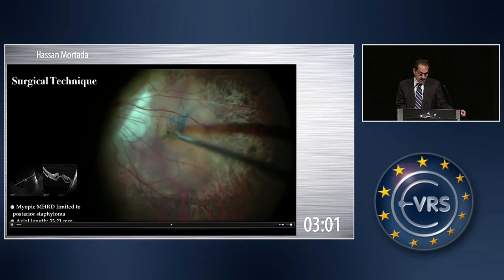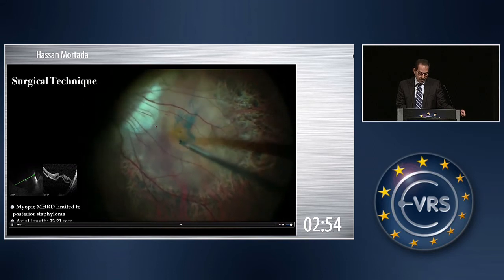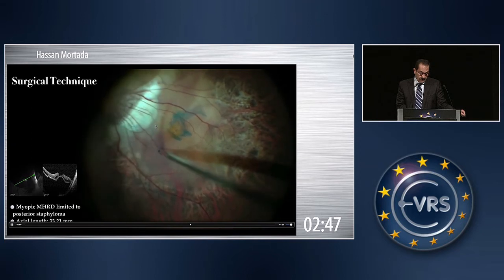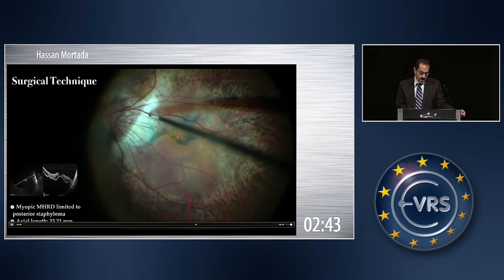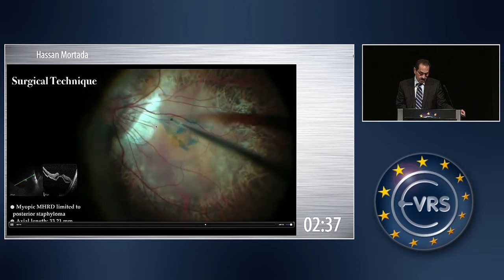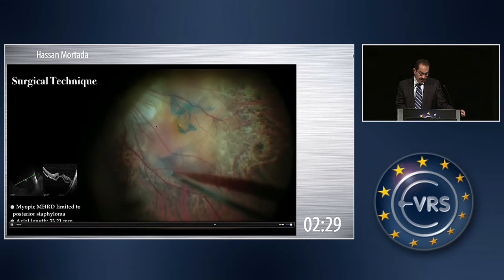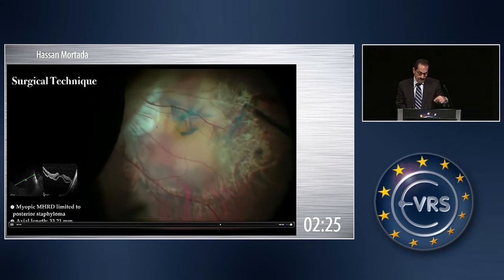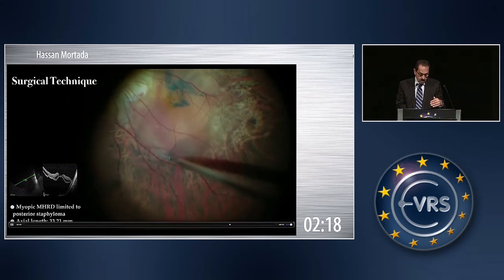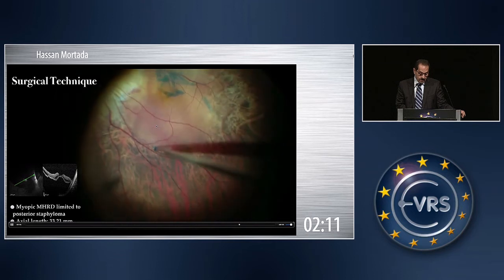It is not important to have the ILM in one piece — it may be fragmented. Especially in these cases, the ILM is thin and it is almost impossible to have it in one piece. The inverted flap has been completed, and now I am going to enlarge the ILM peeling, reaching as far as possible, usually to the edge of the staphyloma. The direction of peeling is around the macular hole, done tangentially to the surface of the retina, slowly allowing the tissue to relax from traction, reaching here to the edge of the staphyloma.